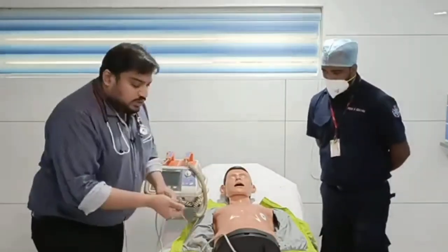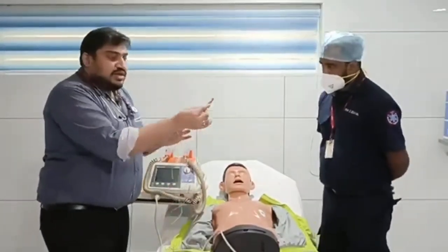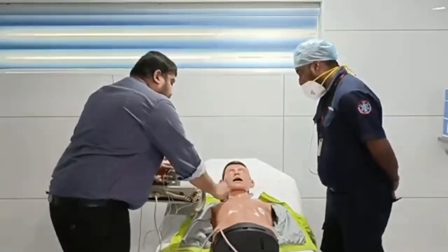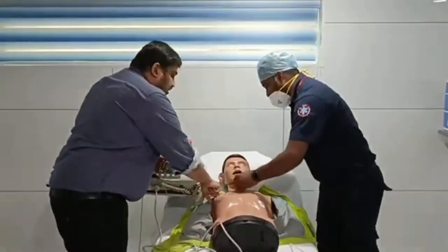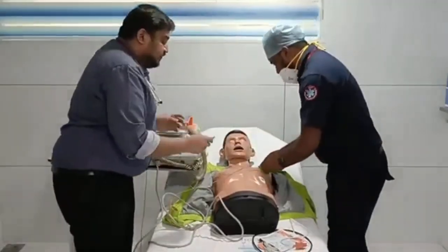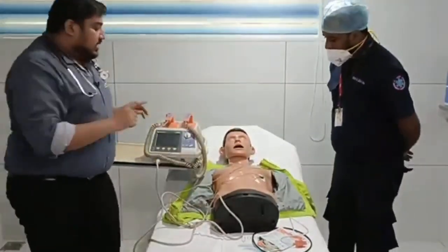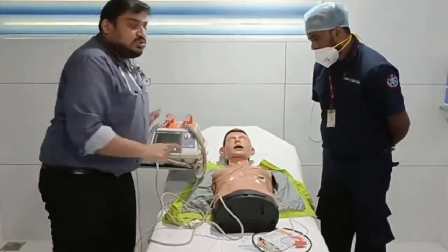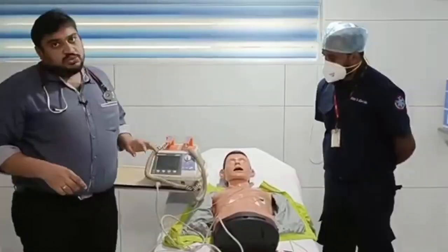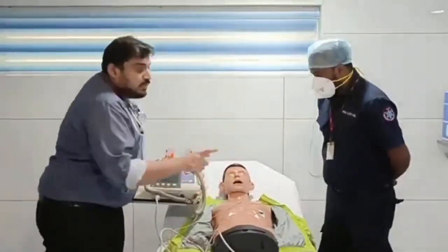So again, how do you connect your defibrillator for monitoring? You have three leads like this: the red, yellow and the green. Red needs to be connected over the right, yellow over the left, and green over the apex. This is the three lead position that you need to remember: red, yellow and green. When you connect this to the defibrillator, it will give you a rhythm. So that is how it functions. Remember red, yellow and green.